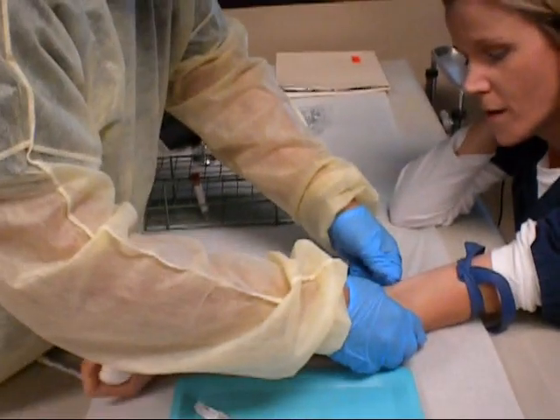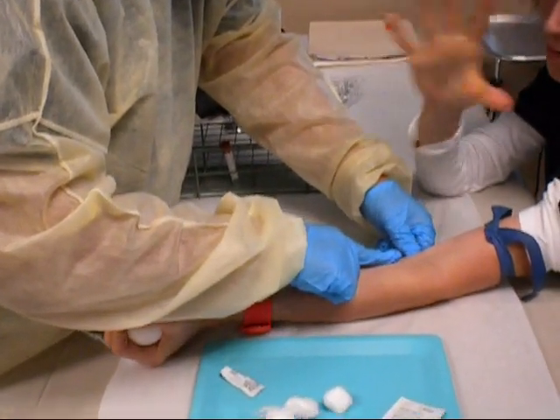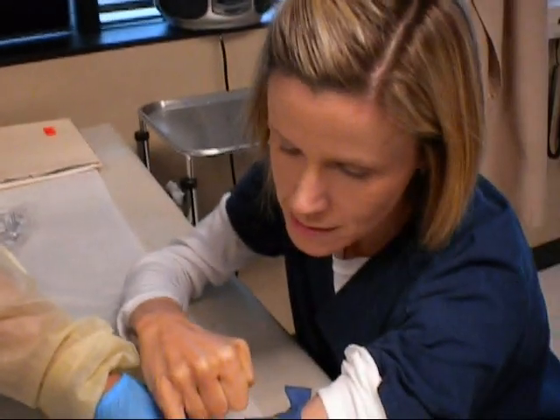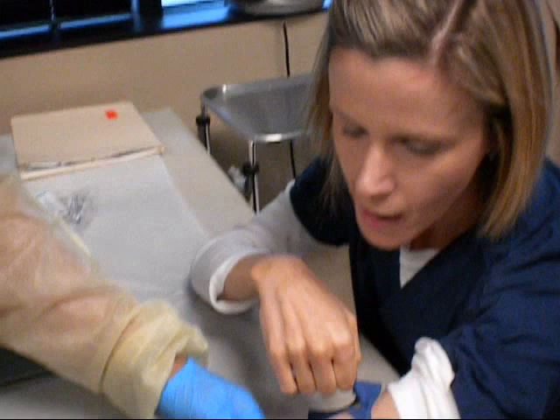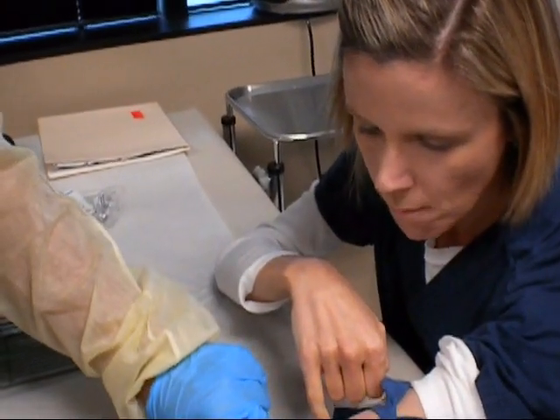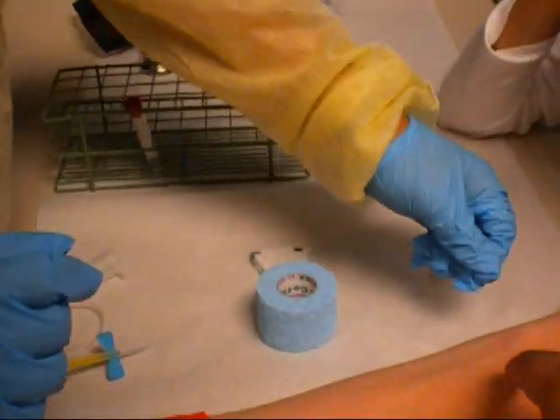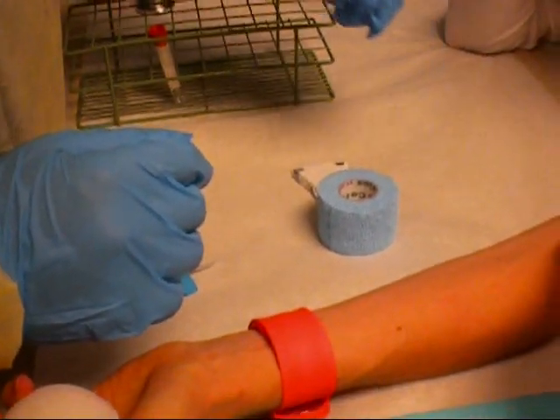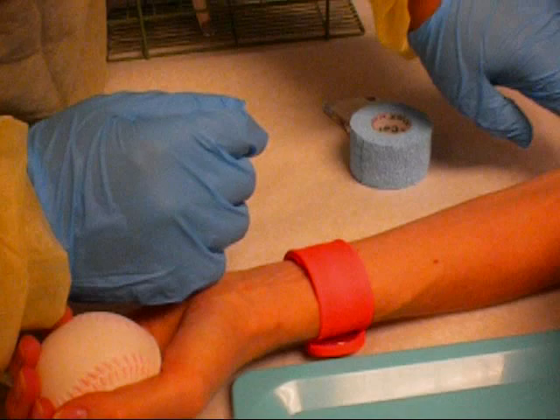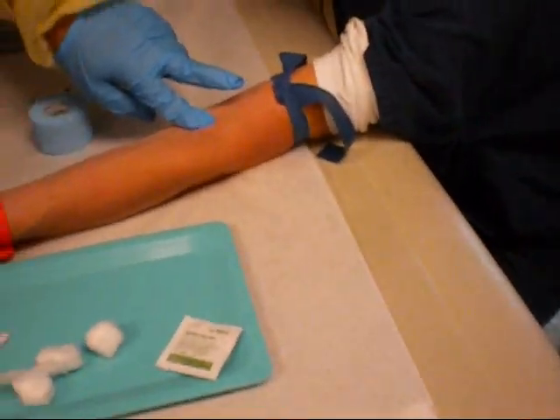This is so cool, I can see your hand. Do you feel it? You want to look for one that's not branching at all, so you know this is looking good. Not with your thumbs though — use your fingers. When you're feeling for it, you haven't wiped that yet, have you? No. So you want to really feel. Take one finger and you can feel. Close your eyes. You feel it? Yeah.